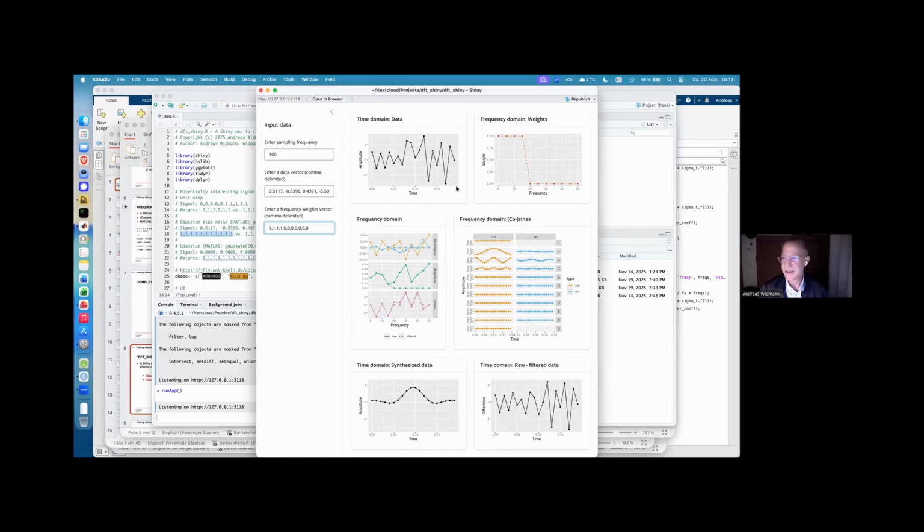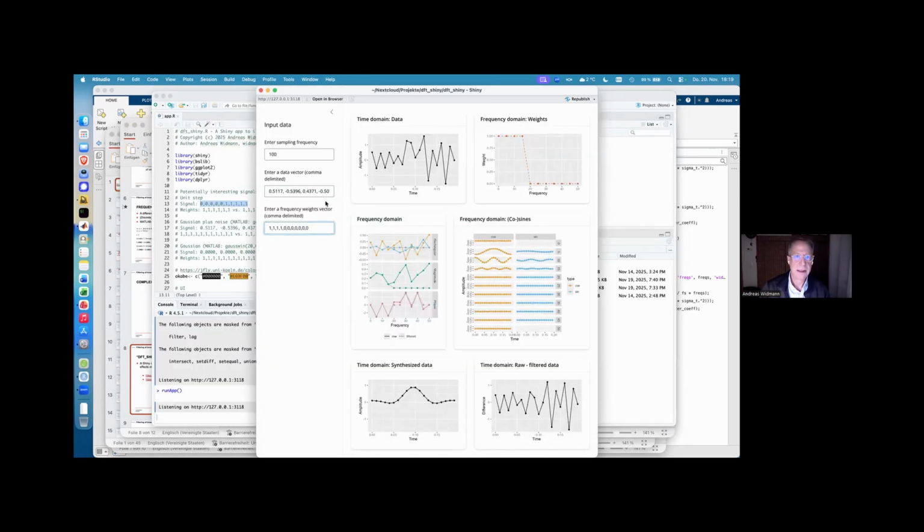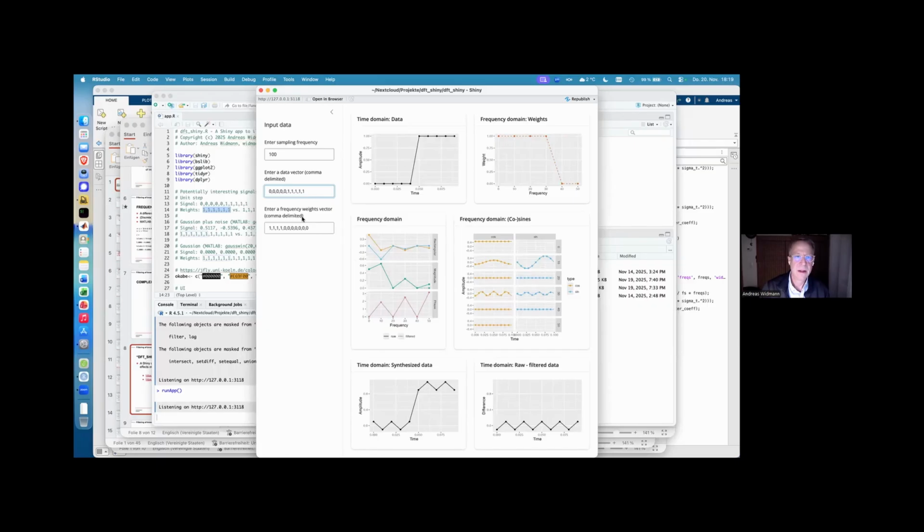But of course, there's always also a dark side. So I would like to go back to our step signal, and the respective weight vector. Again, only once. So we have a step signal. That's a test signal we use very often because you can demonstrate prototypical effects of filters on that pretty nicely. And that is because we have energy or power at almost all frequency components. So of the higher ones, every second is 0, but that doesn't matter. So it's a broadband signal.